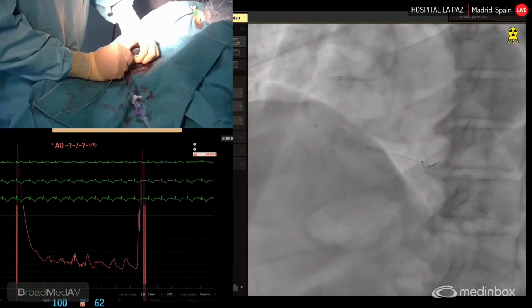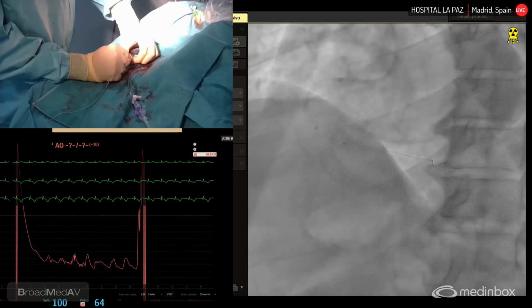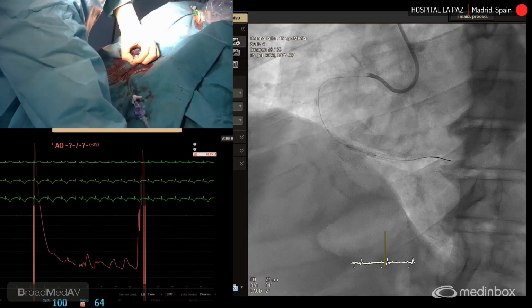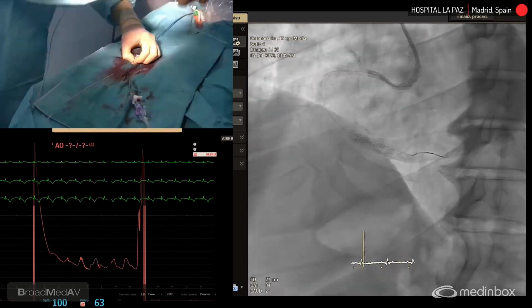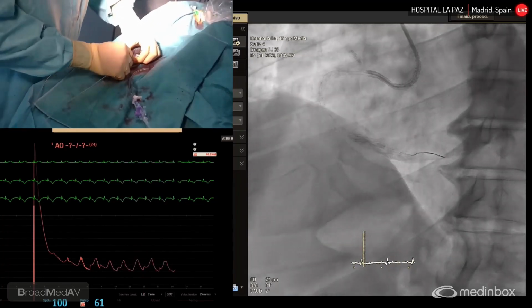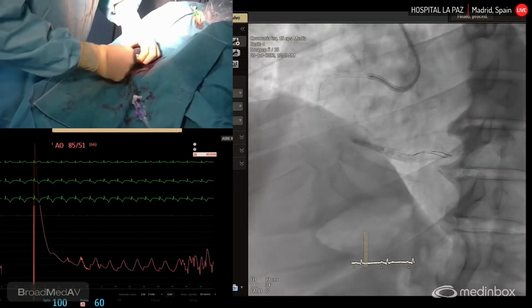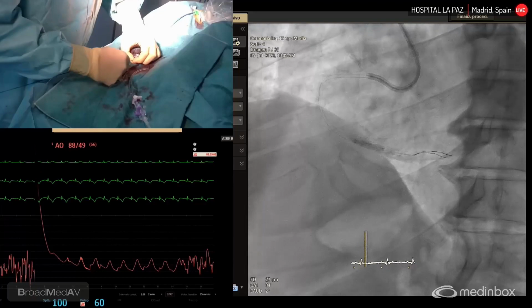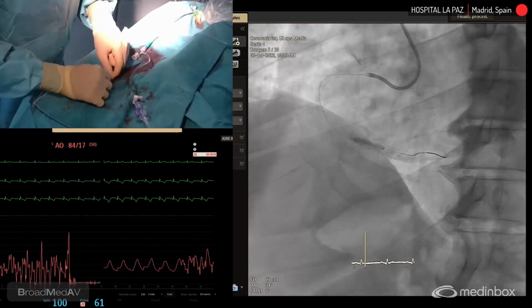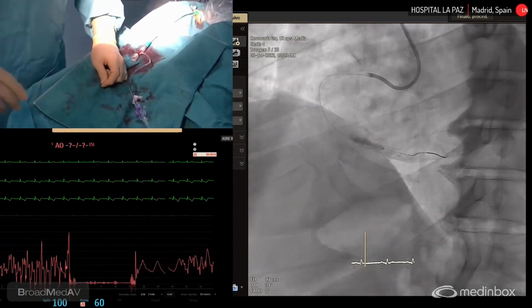Vamos a hacer otra en retirada. Okay. Well, this is the first balloon inflation. You can see the under expansion. Let's make a test, and we will use again the same balloon and dilate in order to observe if the effect of the laser energy has been effective.